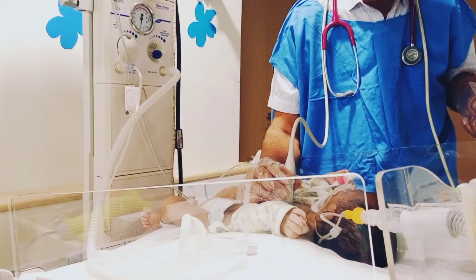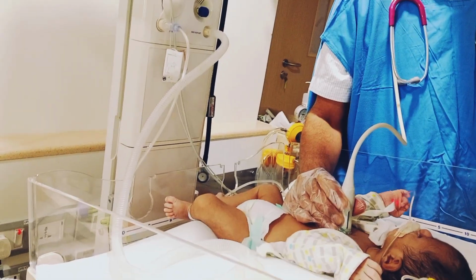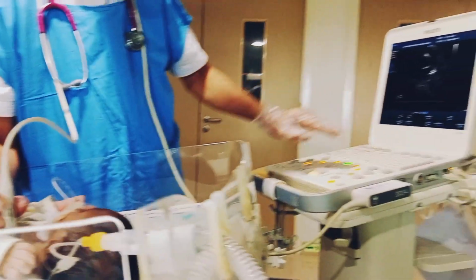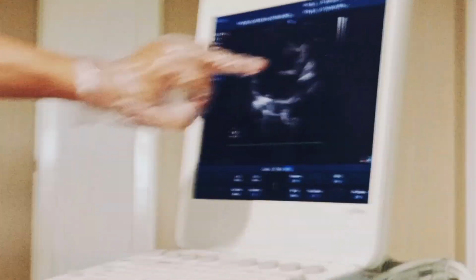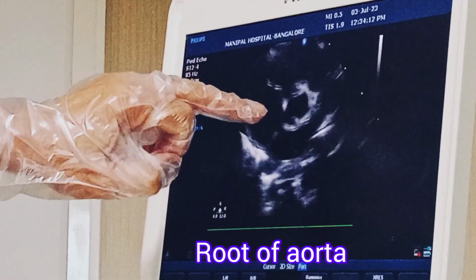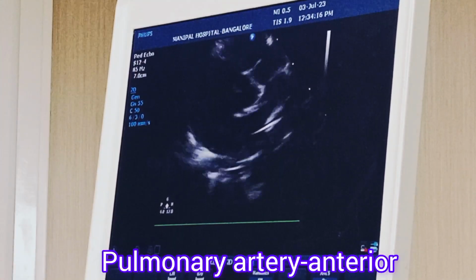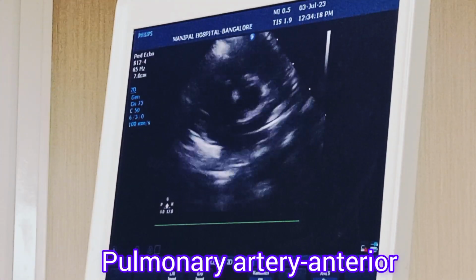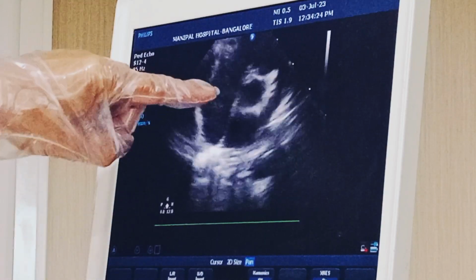Now I'll go to the parasternal short axis. See, can you see that? This parasternal short axis shows that what you see in the center is the root of the aorta. This is the aorta, and what you see anterior to the aorta is the pulmonary artery. I'll just increase the gain. See, now you can see this is the tricuspid aortic valve.